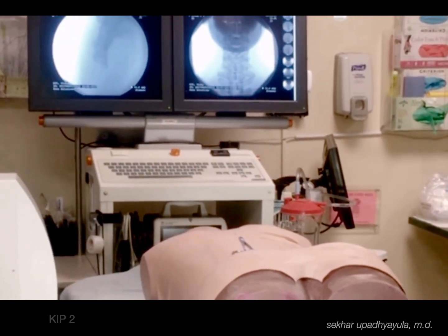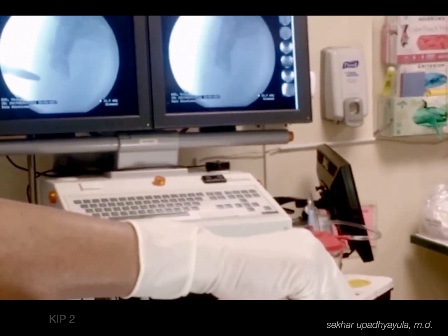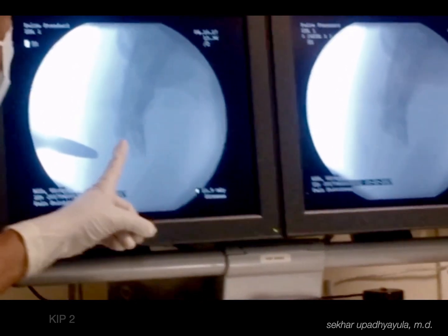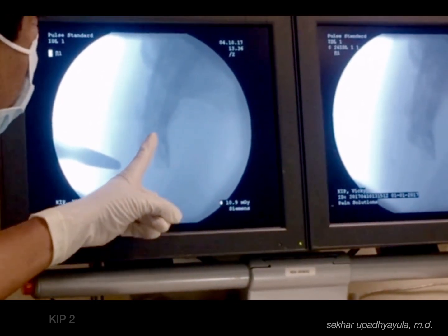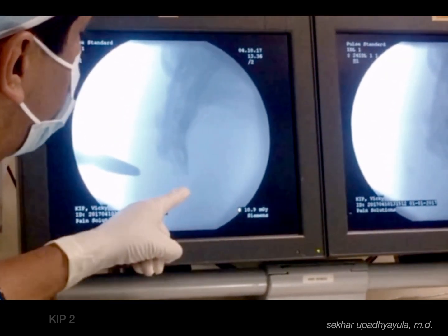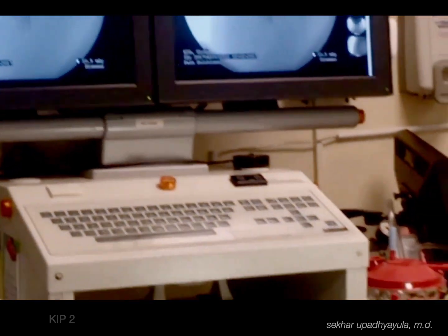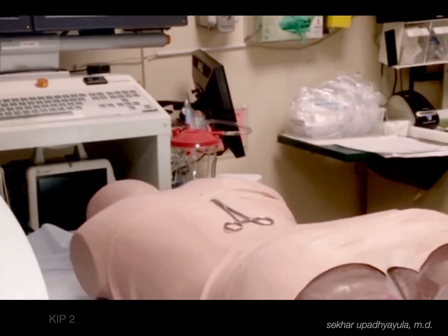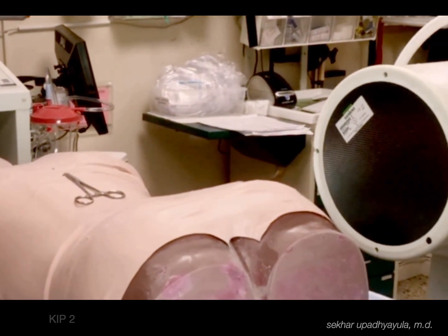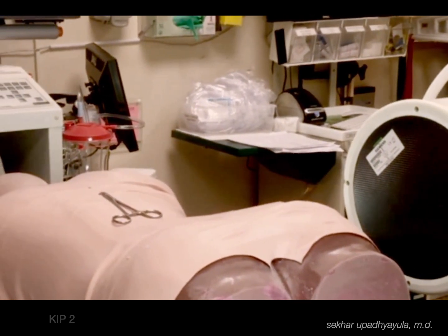If you can see here, this is the sacrum, and that is where the tip of the coccyx would be. So here is, if I was doing a caudal injection, I can see my needle could enter in this area. And again, the distal portion of the coccyx is removed, probably because of manufacturing. They didn't want that to break off. Let's go up a little higher. Let's see what else we have. I think we have to come back down a little bit. Come down a little bit more.